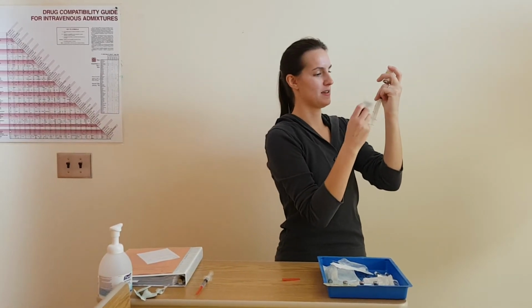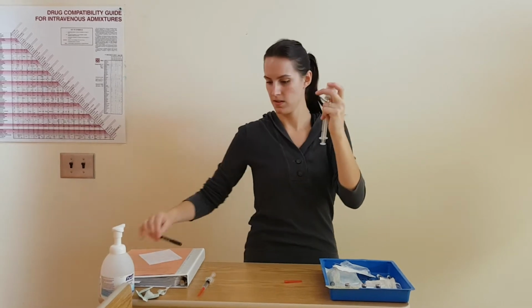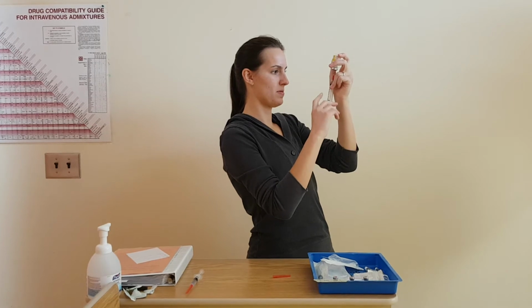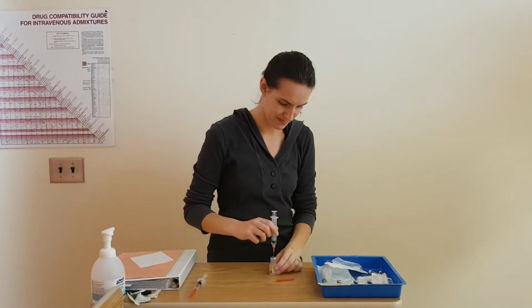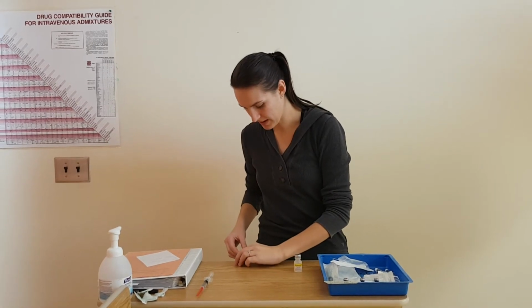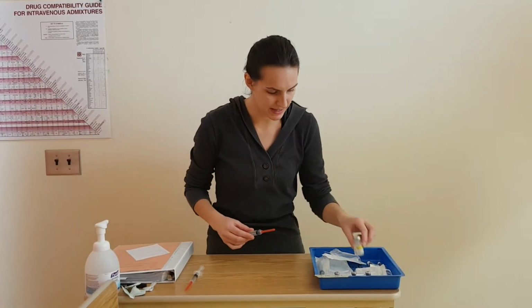The patient that I'm working with doesn't really need any nutrients or anything, and I go 250 instead of 500 because my patient doesn't need it. Just recap this again. Be careful to maintain its sterility.